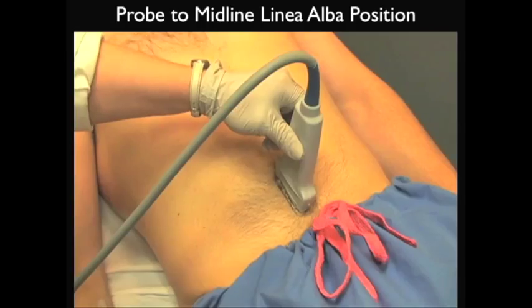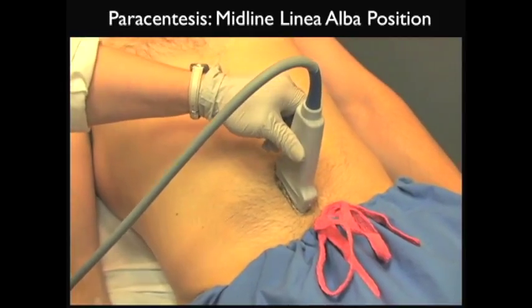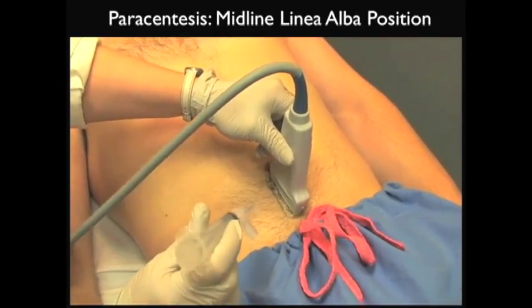While the lateral gutter approach to paracentesis is commonly emphasized during medical training, the midline linea alba position can be a great location for a paracentesis procedure. Note here, the probe is placed along the midline linea alba with a marker dot towards the patient's head, and we see it placed along the midline just inferior to the umbilicus. Here we'll further investigate the midline linea alba position for the paracentesis procedure.